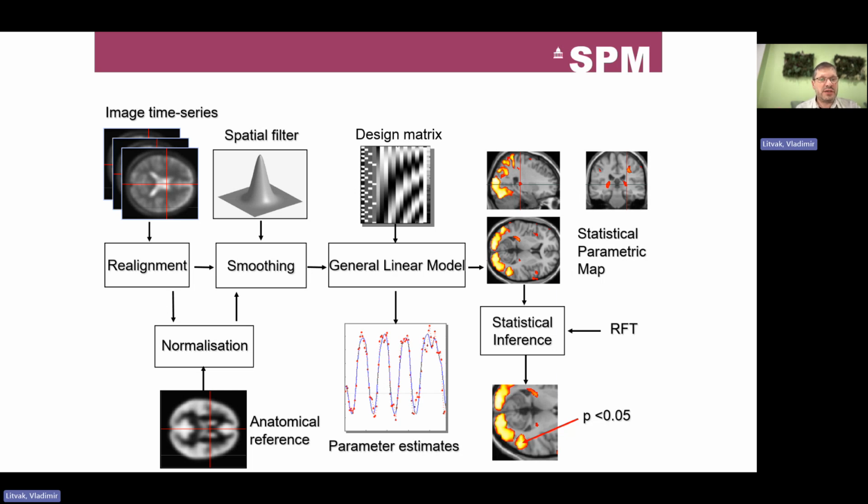The general linear model is basically a very flexible statistical framework which generalizes ideas like t-test, ANOVA, and regression in the same tool. And this analysis gives you some kind of activation patterns in the brain. The next step is to threshold those patterns to determine which ones are statistically significant. And this is done by application of a mathematical framework called random field theory. And eventually you end up with blobs on the brain, in this case, that you must be very familiar with.